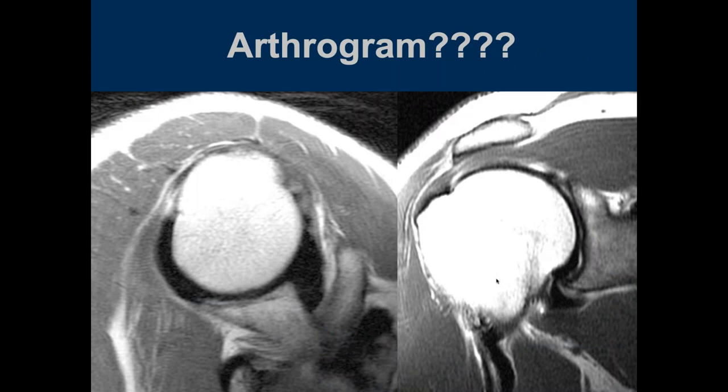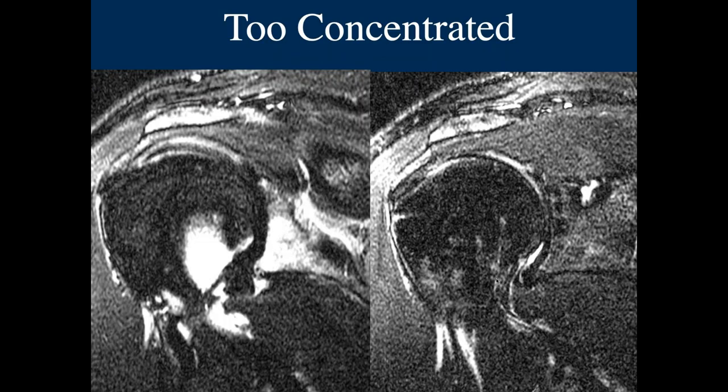Case showing what happens when you don't dilute the gadolinium contrast — the joint space is markedly hypointense on T1 weighted images because the contrast was not diluted. You get very little tissue signal and you can see a little contrast imbibed in the bone. We typically like contrast diluted 200 to 1.